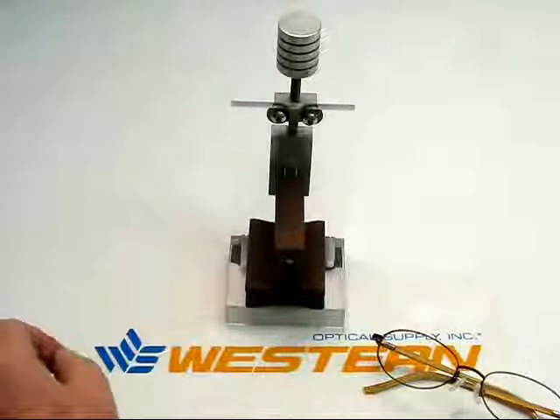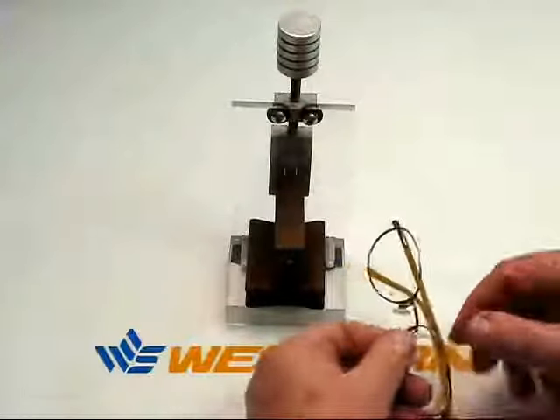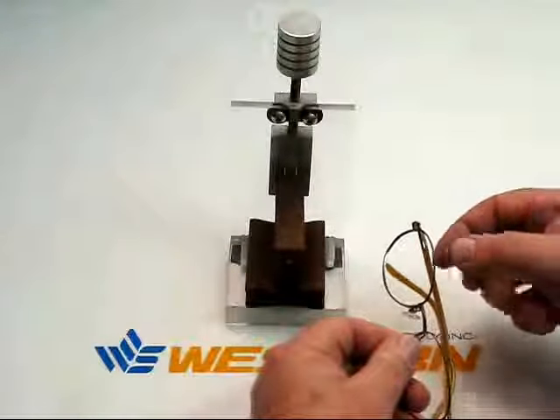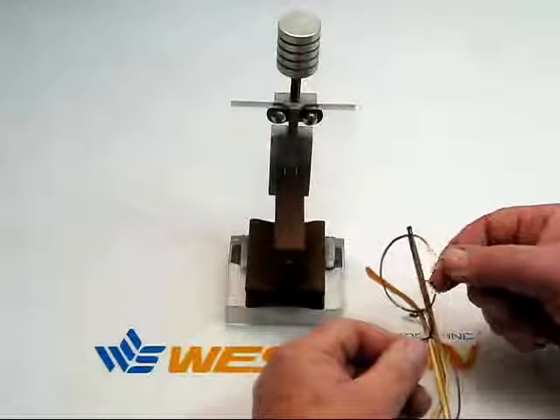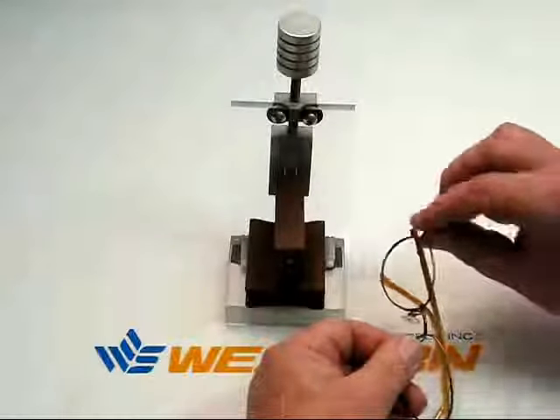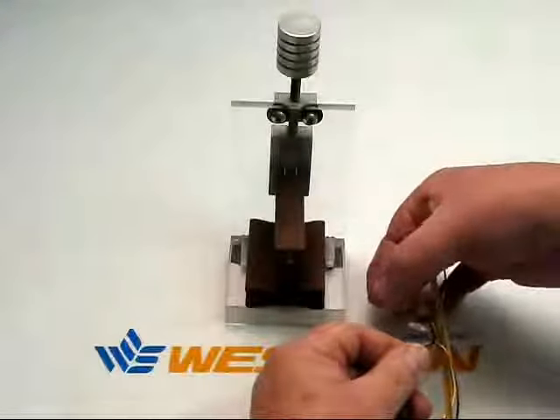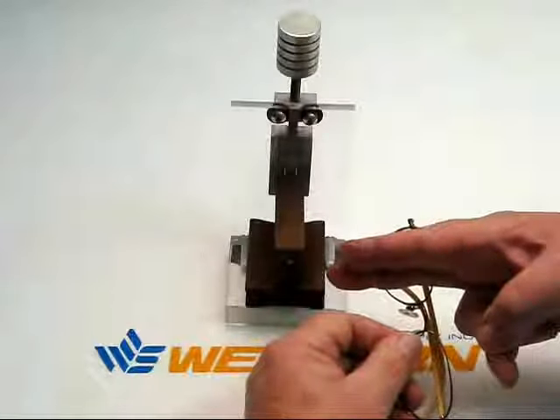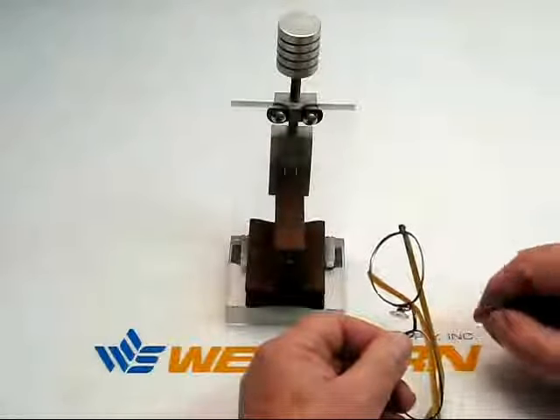A new addition to the Western Optical product line is the eye wire forming press. Normally when you want to bend an eye wire to conform to the curve of the lens so that the bevel of the lens and the groove of the eye wire are more compatible, you use an eye wire forming plier. With an eye wire forming plier, you bend specific areas of the frame one bend at a time. What you ideally want to do is to be able to bend the curve across the entire frame so that you're more likely to have a more secure fit.